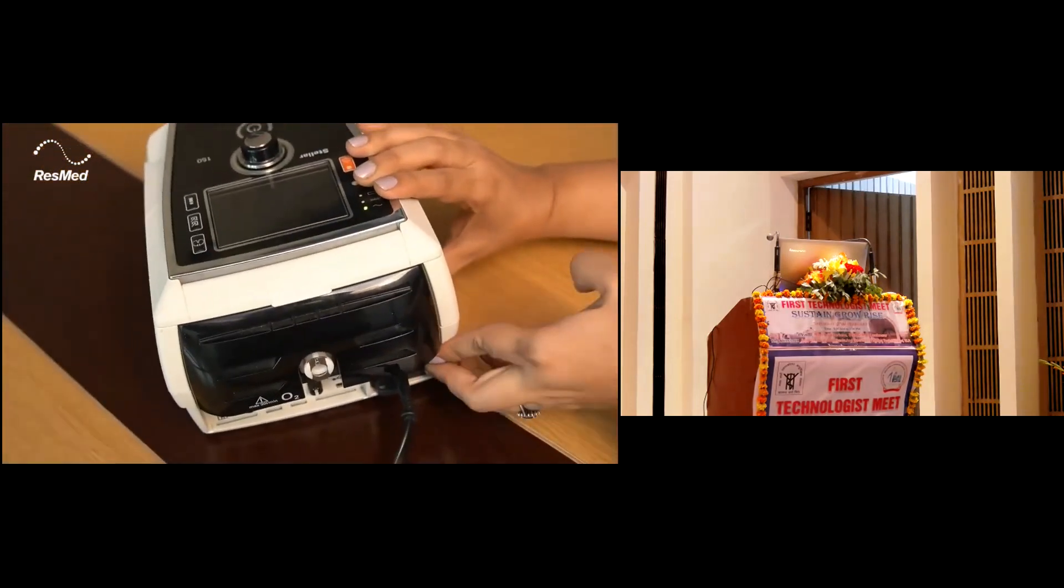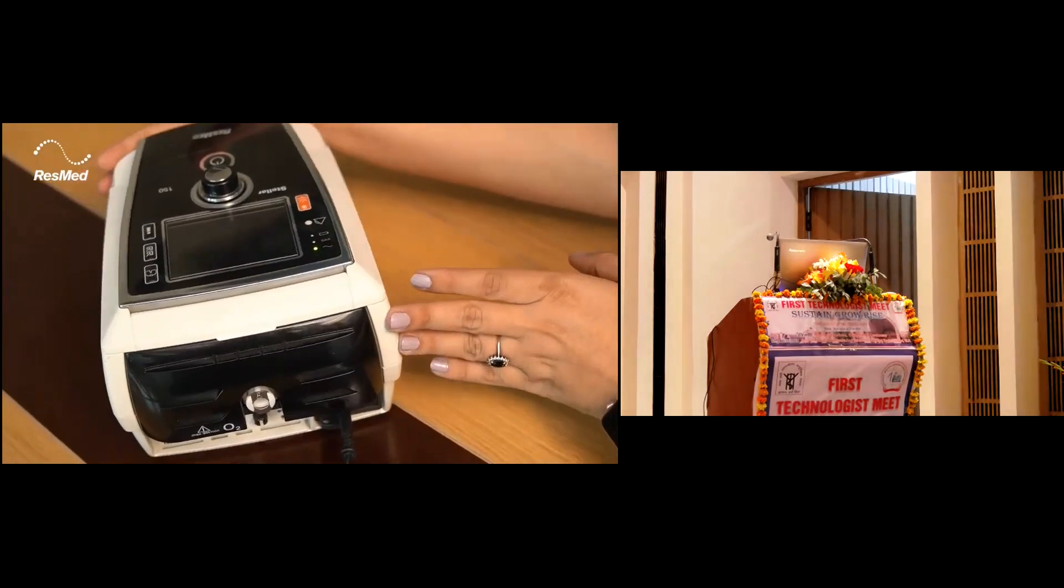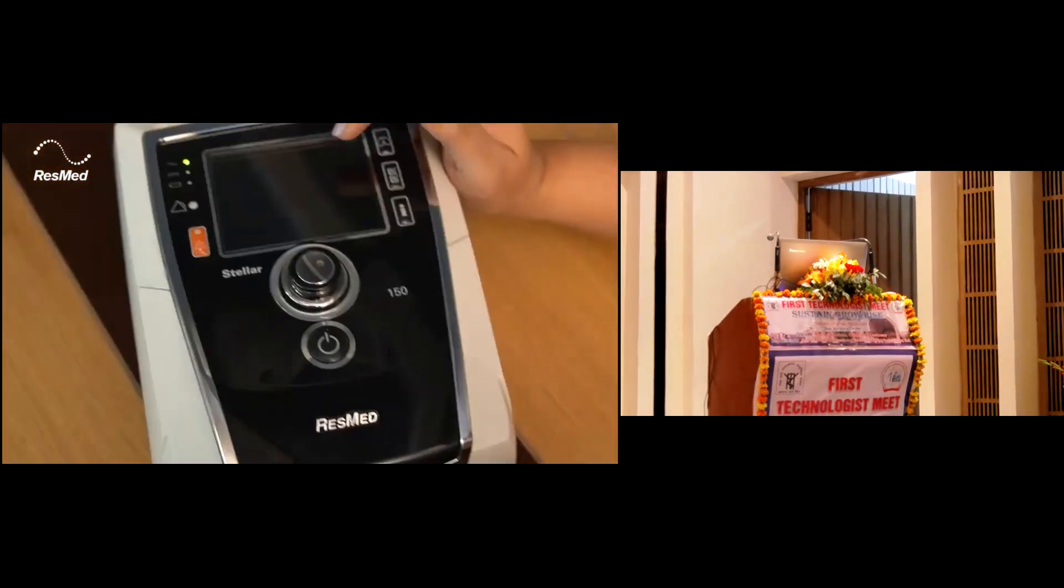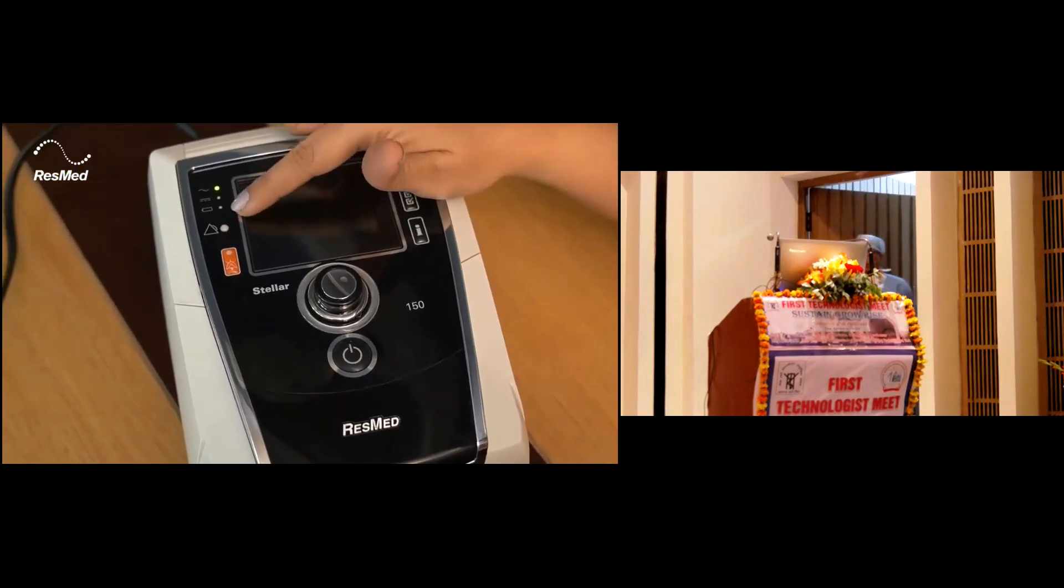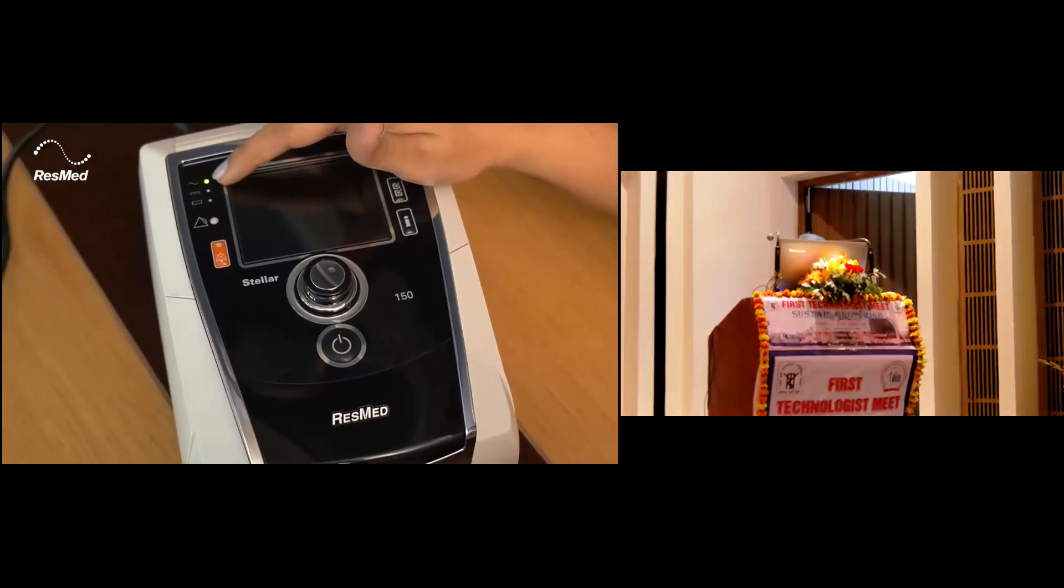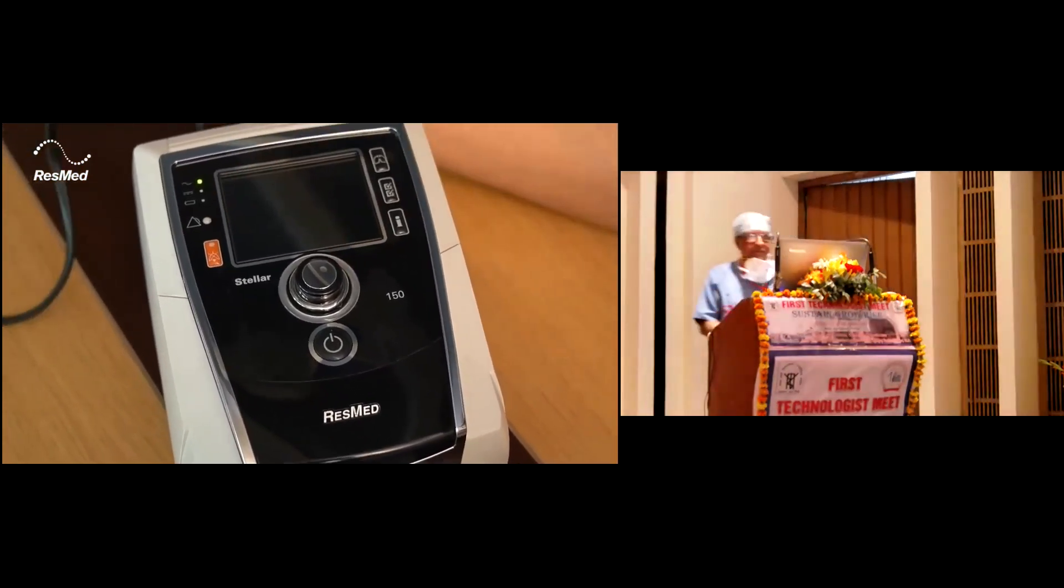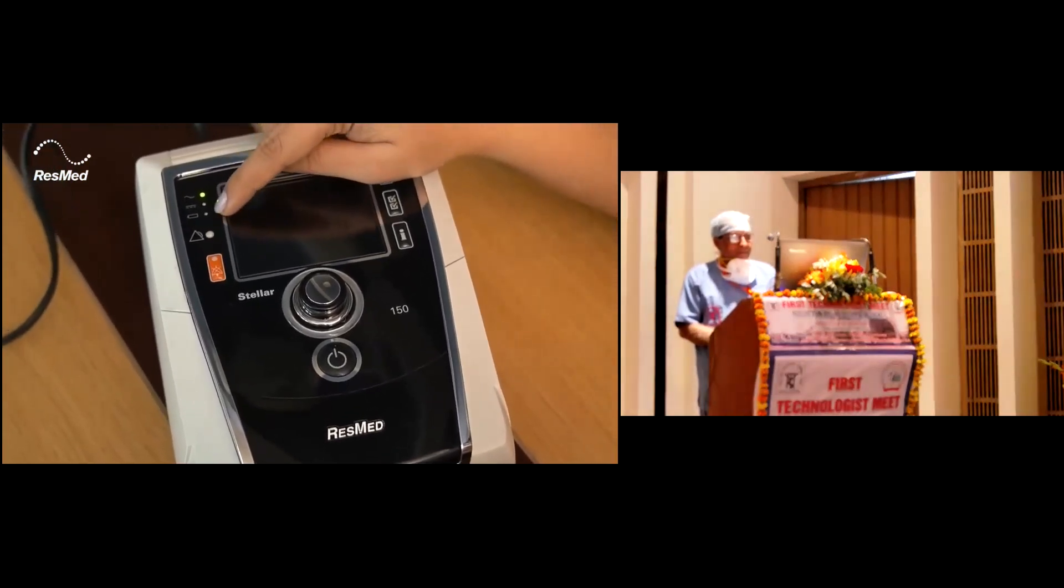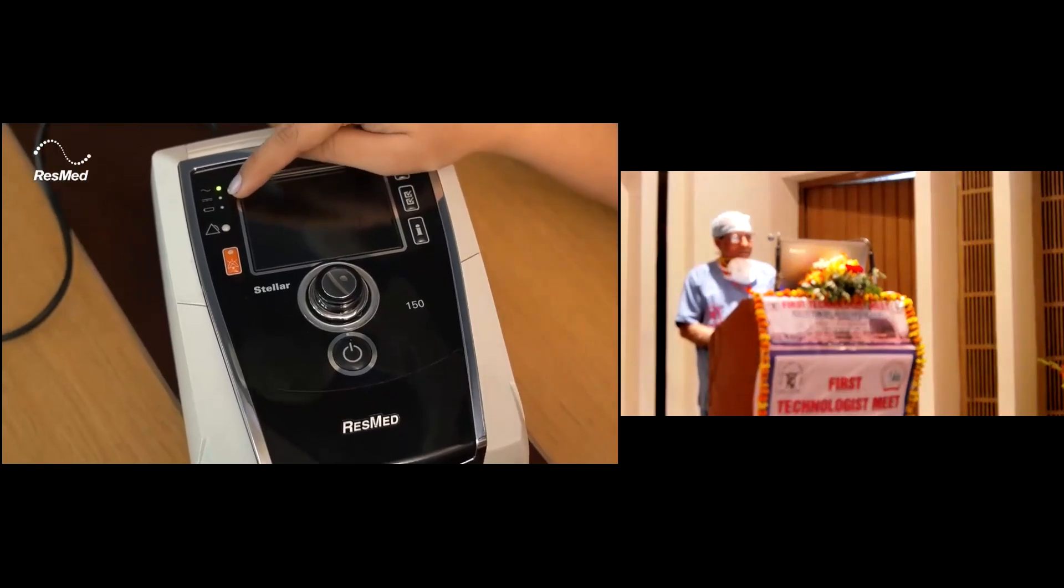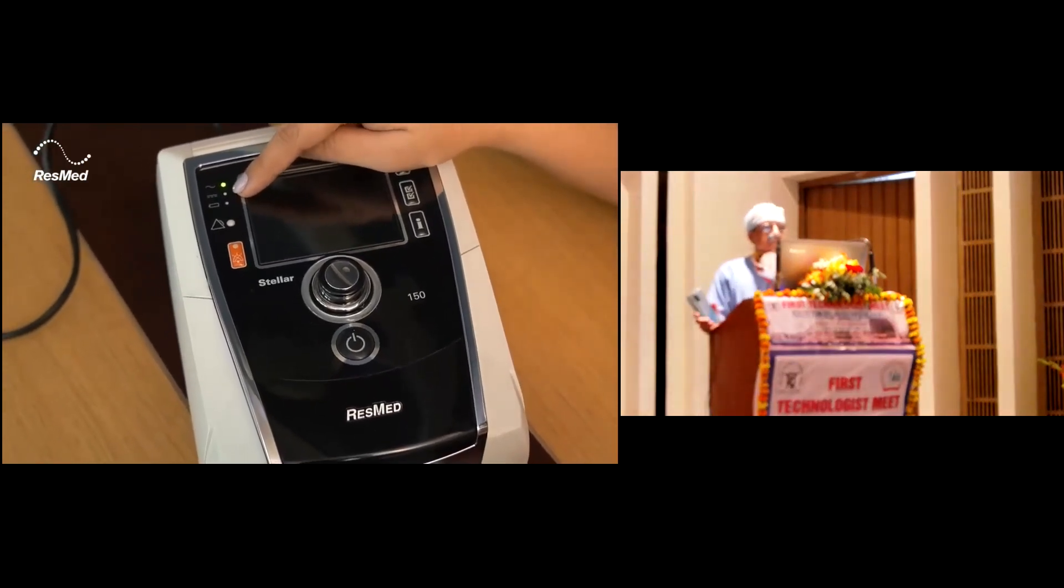Now we'll go to the front of the Stellar. Coming to the face of the Stellar, we have the display over here and the power source indicator. This is the alternating current indicator. Now that the Stellar is charging, we can see the AC indicator is shown. If it was running on battery, this would be lit, or if running on direct current, this would be lit.